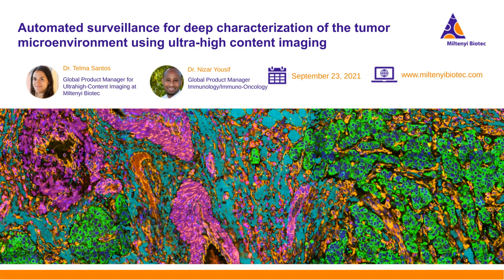As for how long, I would say in general, if you use a PFA or an FFPE sample that has already been retrieved, a couple of weeks to be on the safe side. But as we know, scientists tend to test these limits themselves, and this is very dependent on the sample and the quality of the sample that you're dealing with.